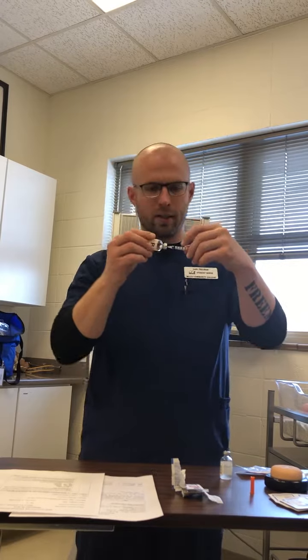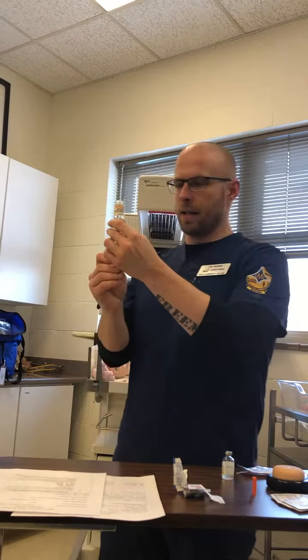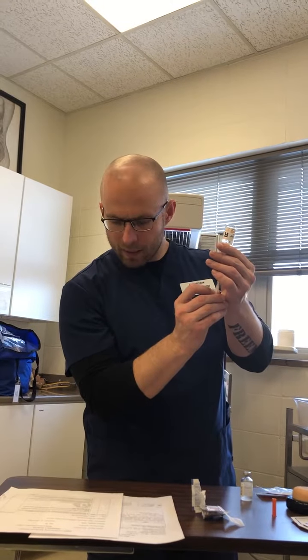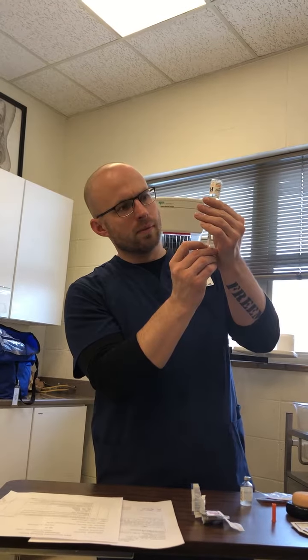We're then going to bring our regular upside down at a 90-degree angle, and we're going to draw back 10 units.